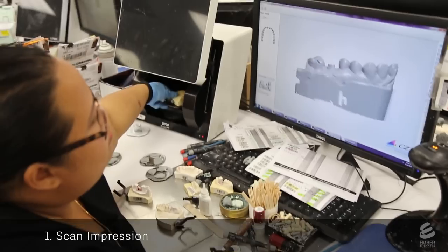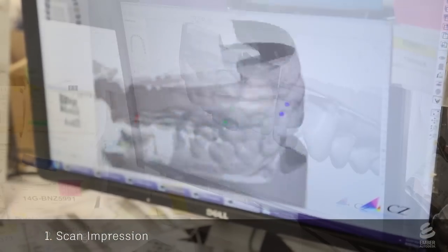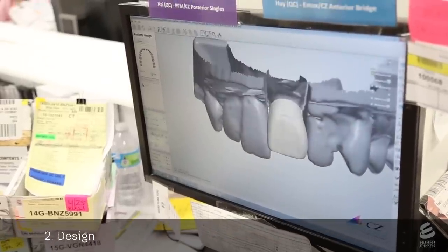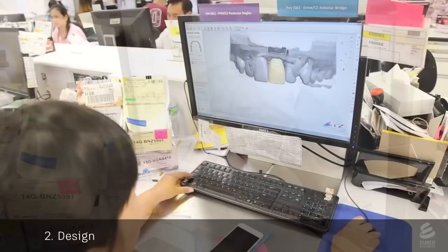They start by 3D scanning a dental impression, which yields a 3D mesh of the patient's mouth. A dental technician inserts a model crown into the mesh of the mouth. They use specialized software to orient and size the crown.